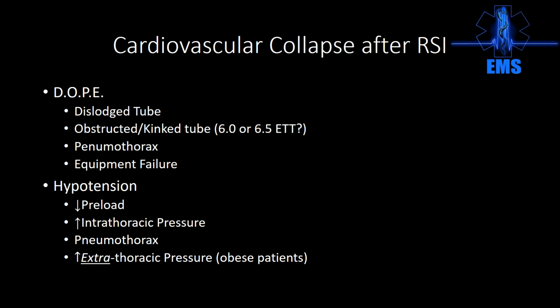The next thing you need to think about, if that's not the source, is the intrathoracic pressure. And this comes from a spontaneous pneumothorax that then causes a tension physiology. This also can come from somebody who has COPD and has air trapping. So how are you going to know this? The bag's going to be really hard to squeeze. You're going to stick 2 needles in the chest. You're not going to get any air out. Now you have 2 pneumothoraces and the patient's still hard to ventilate.